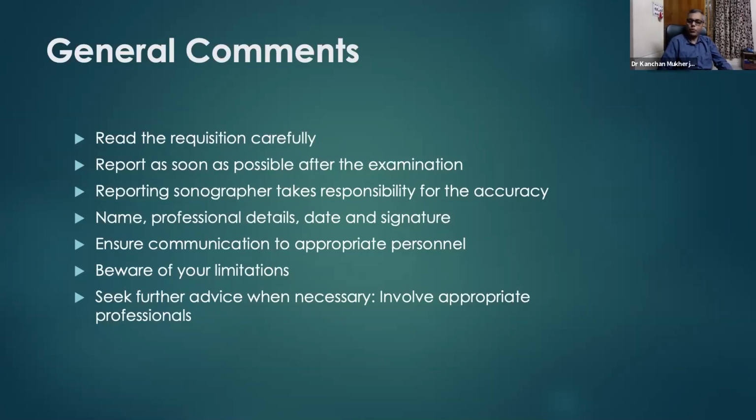And then write the report as soon as possible after the examination. Don't let them build up for 2-3 days and you write at your own convenience. Obstetric reports are almost always needed on the day or the day after.